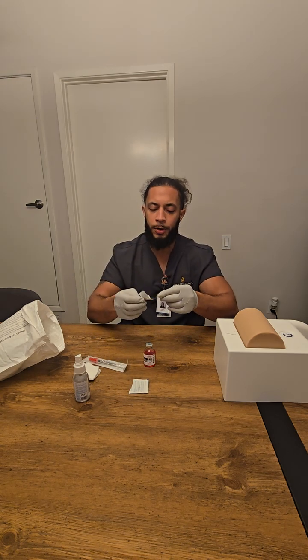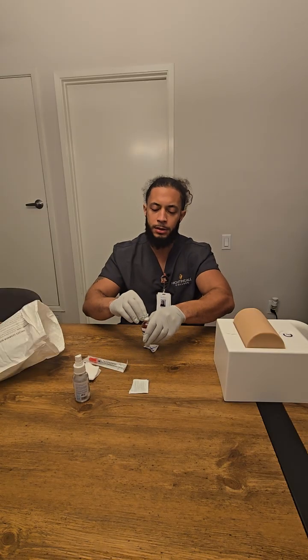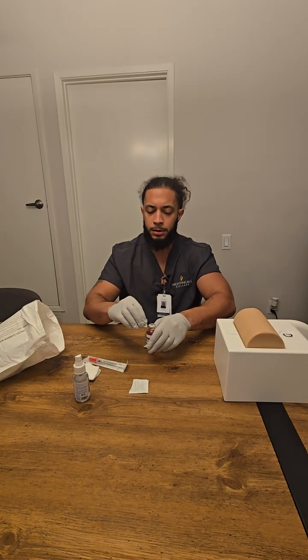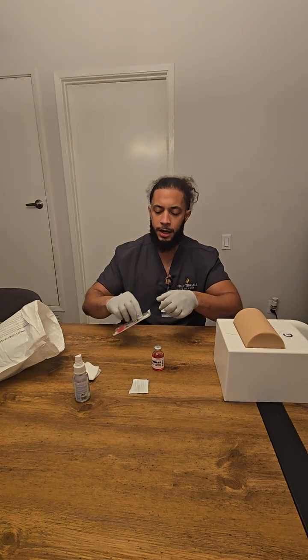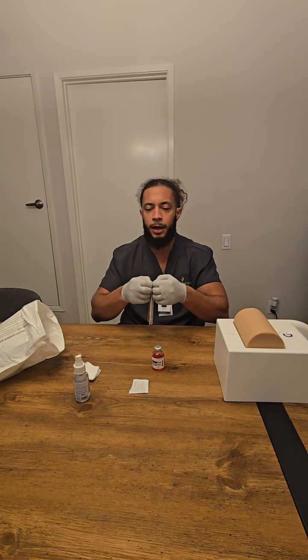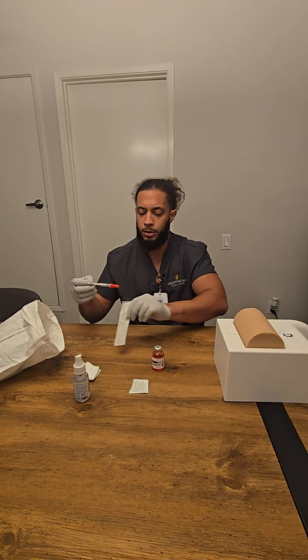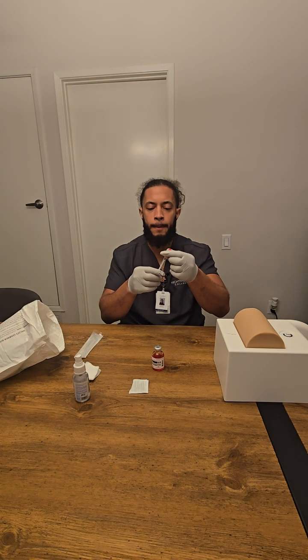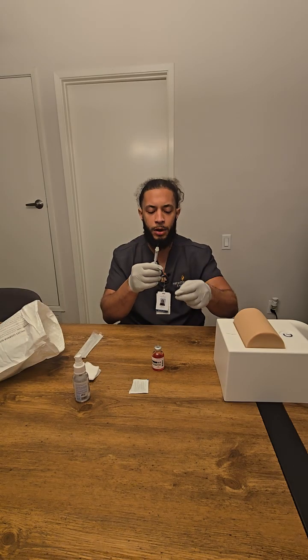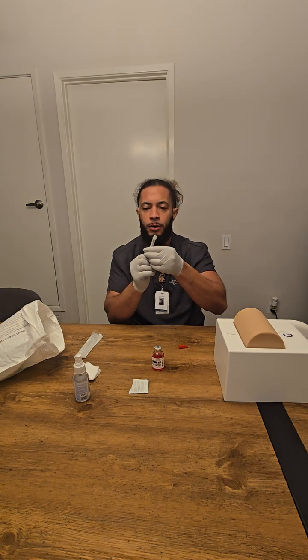Now I'm gonna open up my alcohol swab and clean the top of my medication. I'm gonna let it air dry and put that to the side. While it's air drying, I'm gonna draw up 1 mL of air.